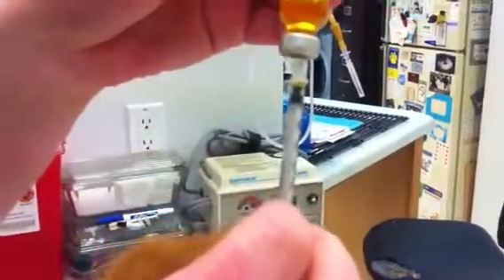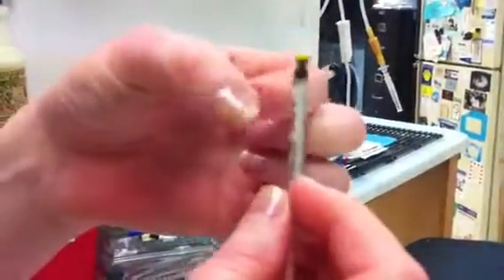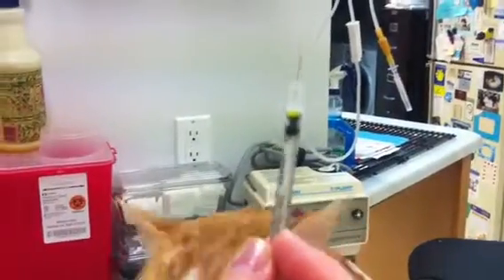After you've got your insulin drawn up, check for air bubbles. If you have any air bubbles, you can easily flick them out and they'll go to the top of the syringe.